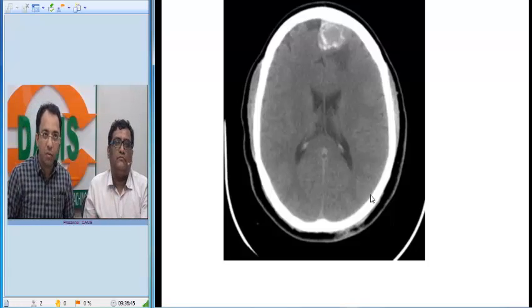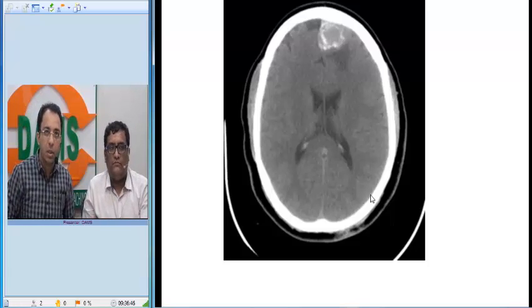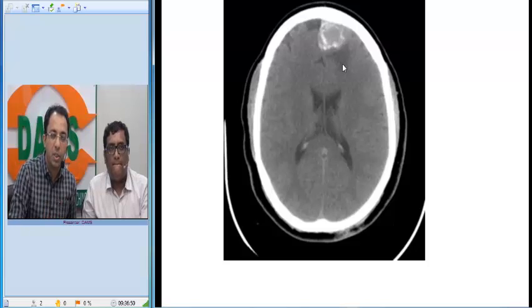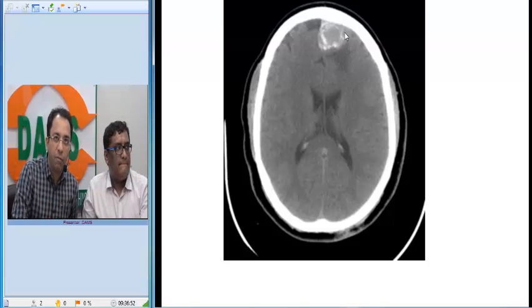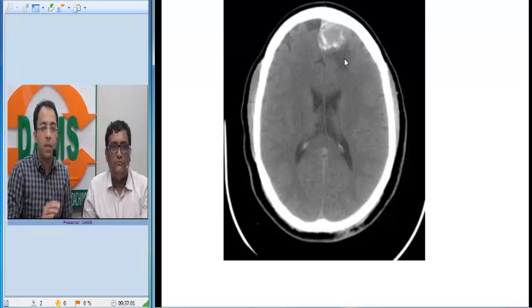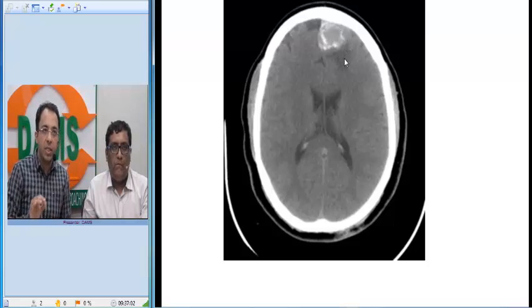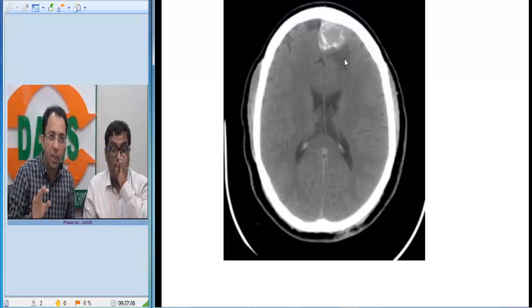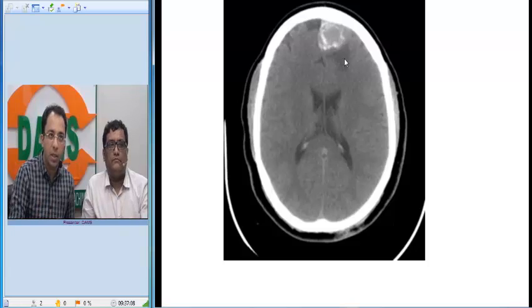Here is a CT scan of the patient where we are able to see in the left frontal region a well-defined lesion which is abutting the falx and the frontal convexity, with a little bit of surrounding edema. So we have a calcified lesion in a 32-year-old female abutting the falx cerebri on the CT scan.